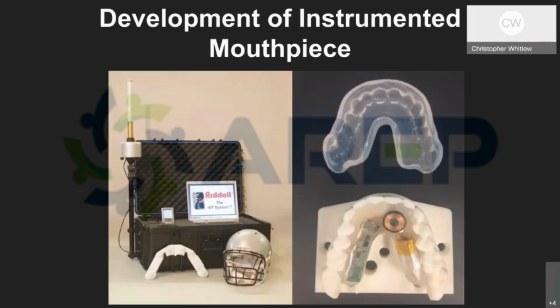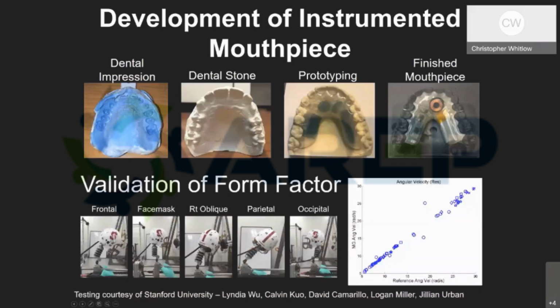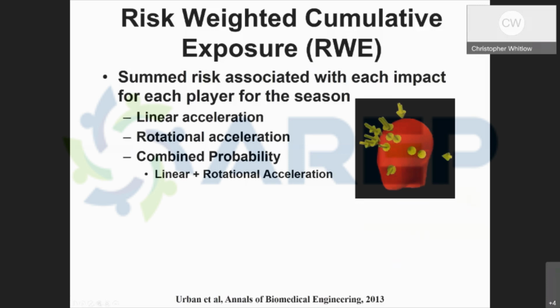Of course, we are now transitioning over to our mouthpiece-based sensor designed by Dr. Stitzel and his team that really tightly couples to the maxilla and has better kinematics to allow us to measure head impacts, particularly in non-helmeted sports. We've collaborated with our friends at Stanford and spent a lot of time validating our mouthpiece sensor and conducting field testing. And we're deploying these in girls soccer. It seems to work pretty well, and they wear it pretty readily.